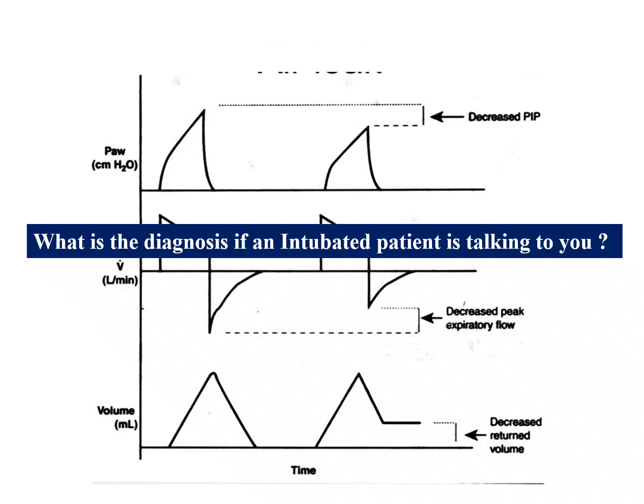If the patient is intubated and is talking to you, that means the leak is at the level of the ET cuff. Leak can happen from the endotracheal cuff, from a bronchopleural fistula, to the endotracheal cuff, to the circuit somewhere. Anywhere a leak can happen, and once you diagnose the patient as having some leak, you have to algorithmically see where the leak is coming from.